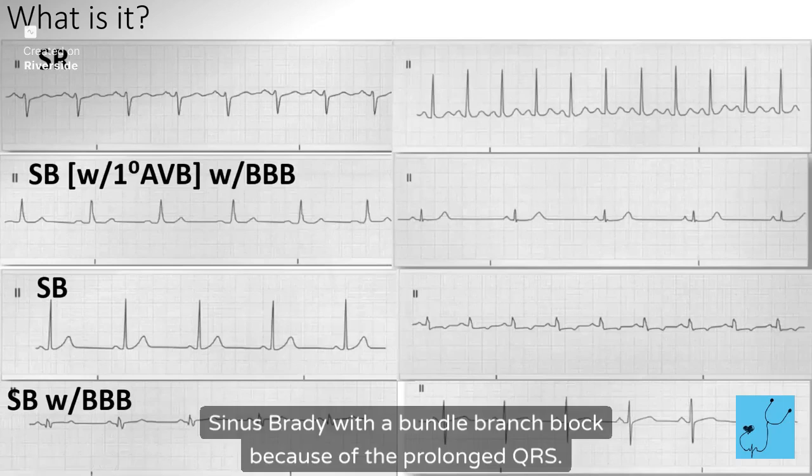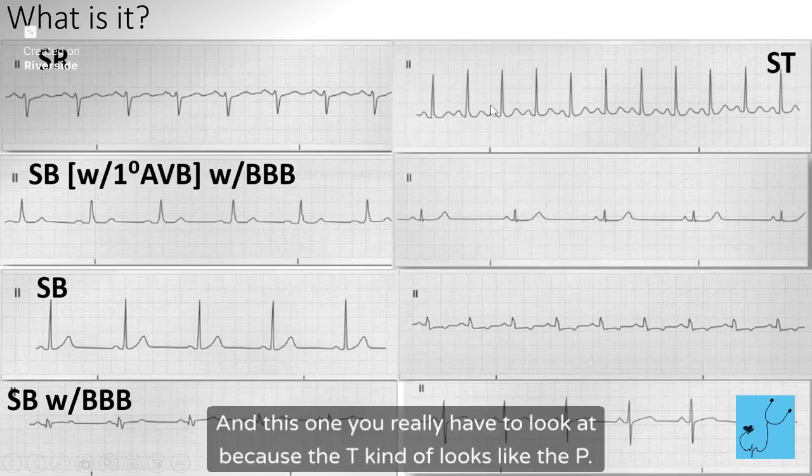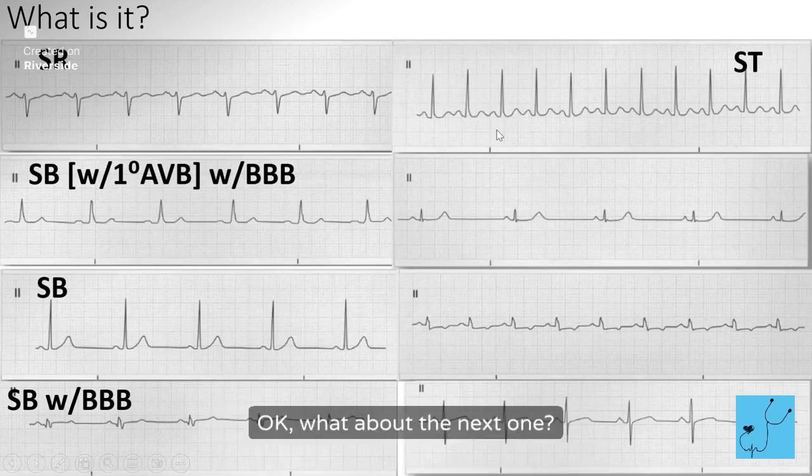So sinus Brady with a bundle branch block because of the prolonged QRS. How about this one? Sinus tach. And this one you really have to look at because the T kind of looks like the P. You know, they kind of go together.